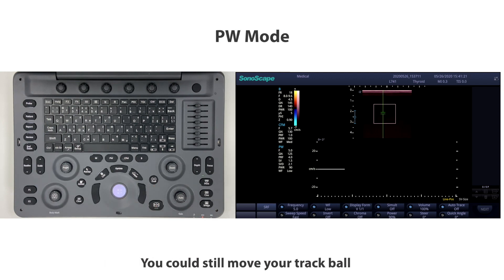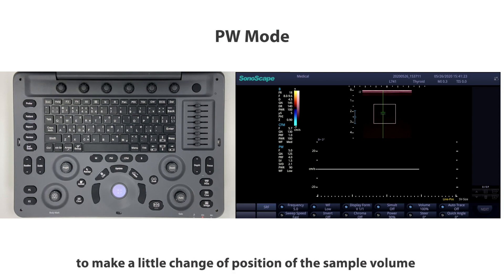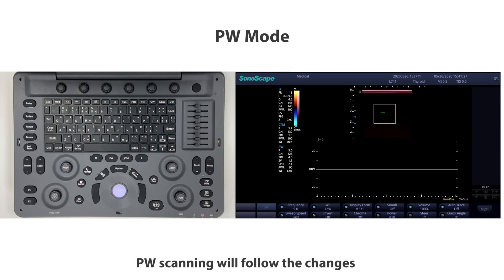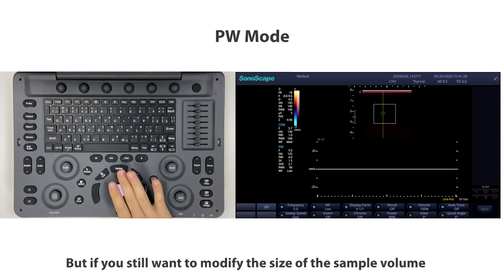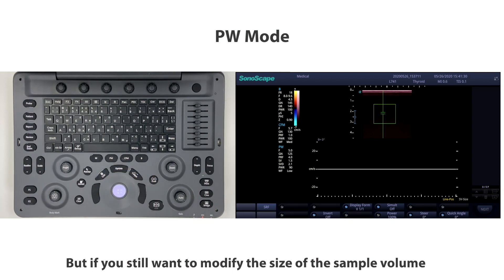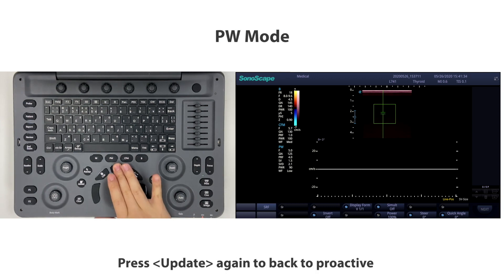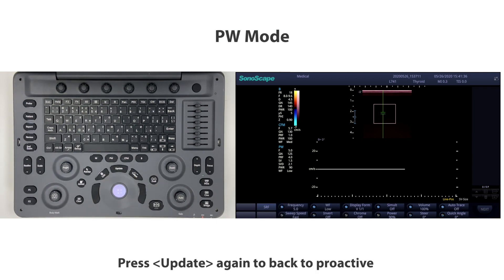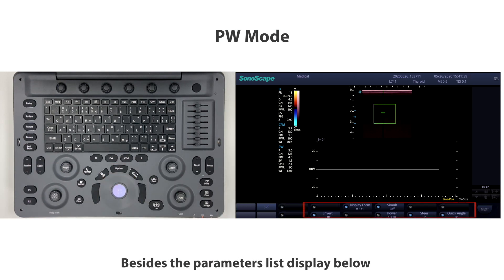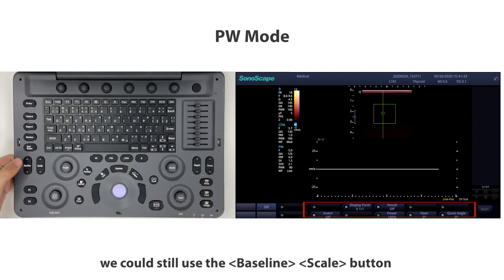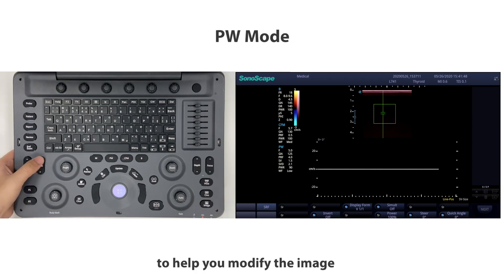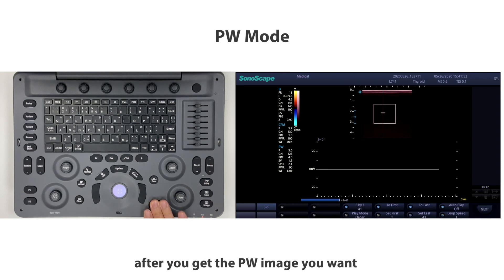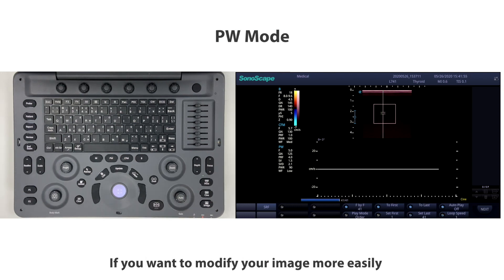Press Set again after finishing volume adjustment, then press Update to activate PW scanning. You can still move the trackball to make small position changes to the sample volume, and PW scanning will follow the changes. If you want to modify the size of the sample volume, press Update again to go back to adjustment mode. Use the baseline and scale buttons to help modify the image.